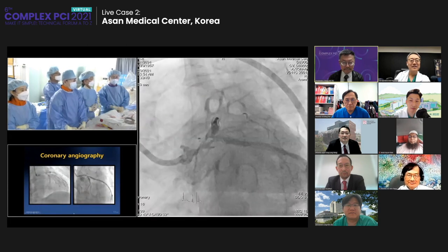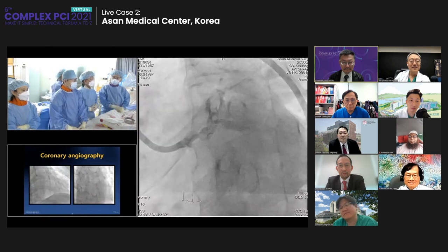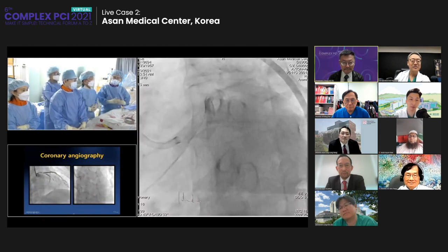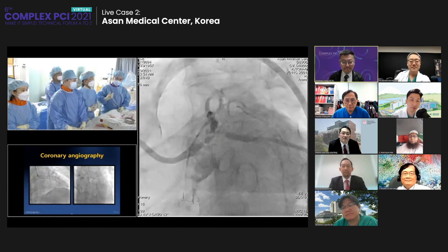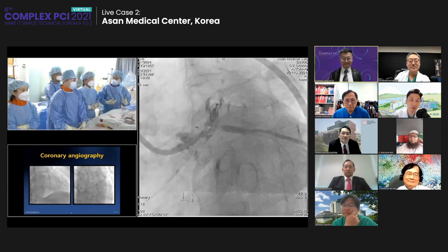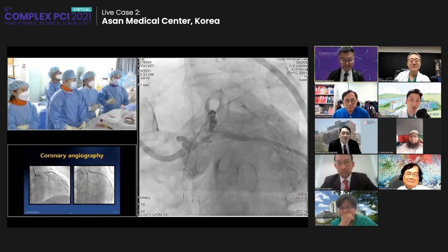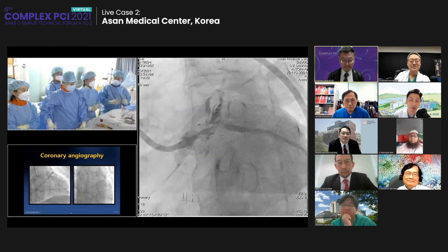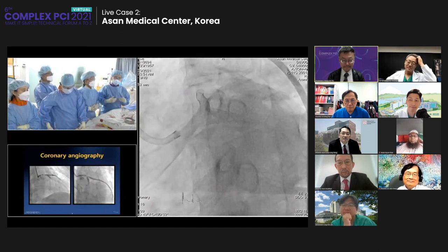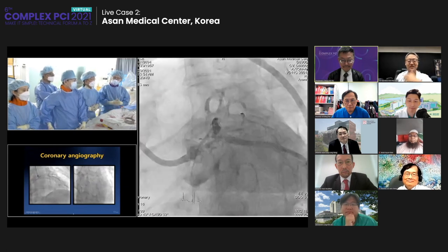So I think there is another opportunity to treat the patient with PCI if we perform it very well with larger sizing and debulking if needed, and make a larger effective stent area again. And we'll treat the medical treatment very aggressively. And if we get the patient all right with another PCI, then she'll be very happy.